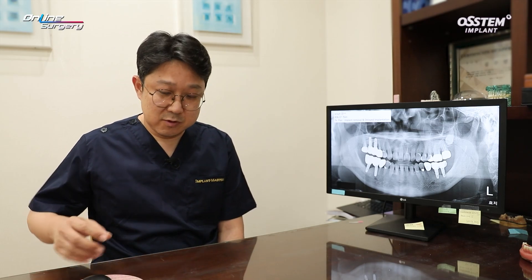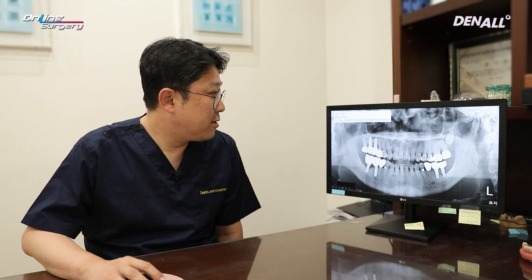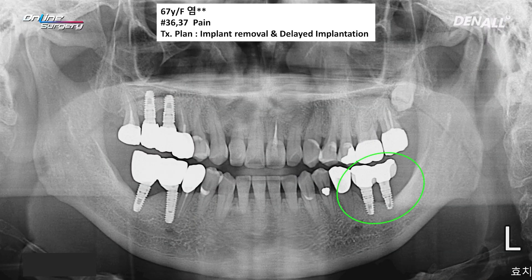Today, we are going to talk about how to retrieve failed implants and provide a re-treatment. Let's have a look at an initial visit image. A 67-year-old female at number 36 and 37 implant sites had increased bone loss and developed inflammation. So she came to our clinic for treatment.